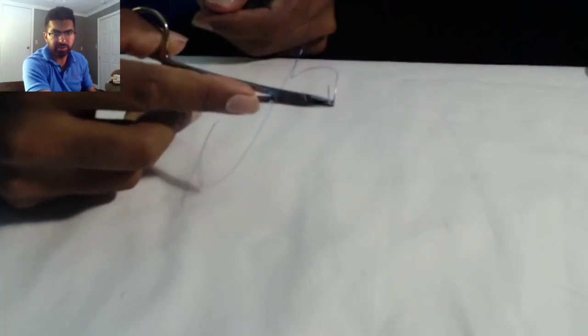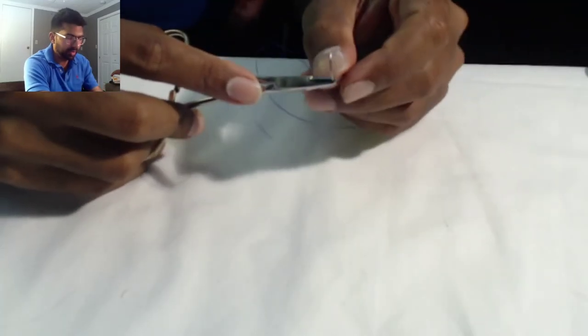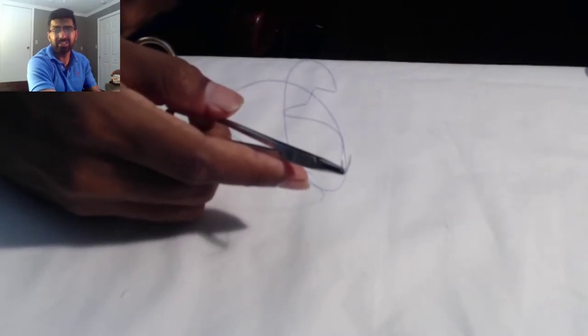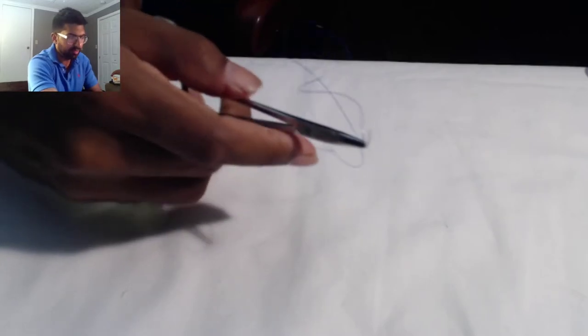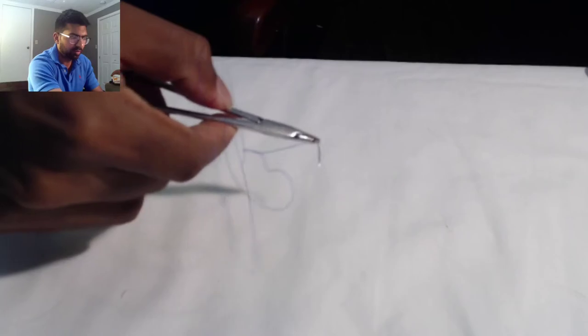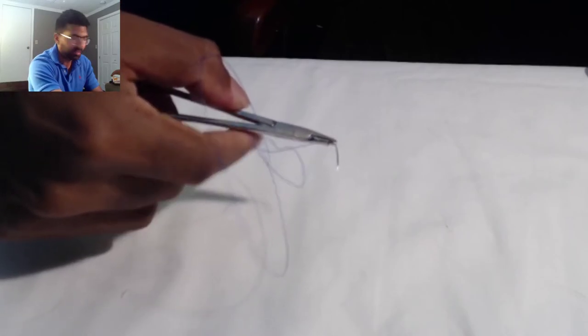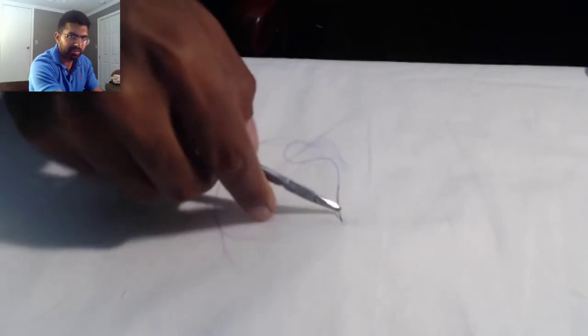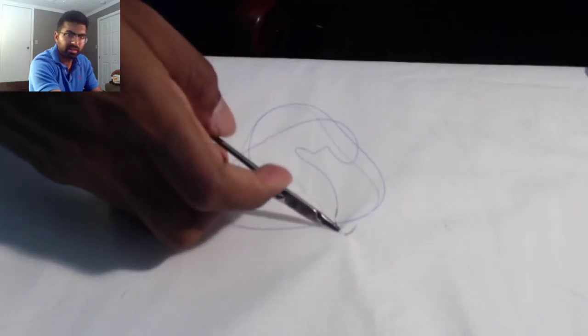So that is how you throw it with your fingers in the hole. Now, I'm going to quickly jump to palming it because it's very similar. Now, with the palming, the only difference is that you may not feel that tension when you hypersupinate the needle. Not your hand, because you can essentially roll the needle back like this, take the bite, and then you notice my hand is just rolling the needle driver.